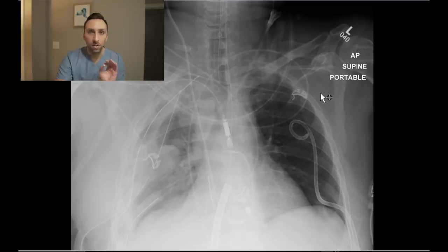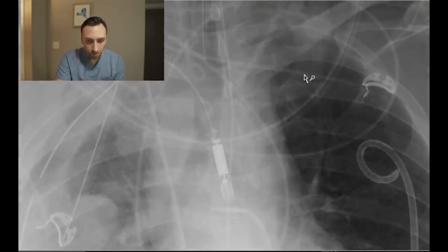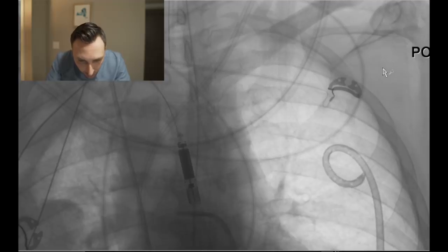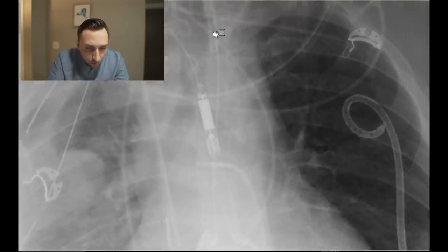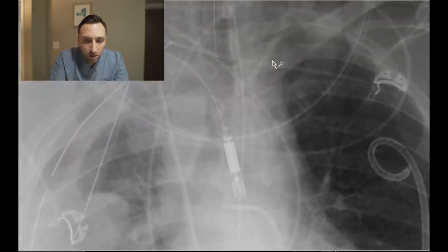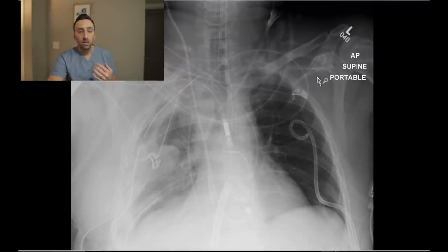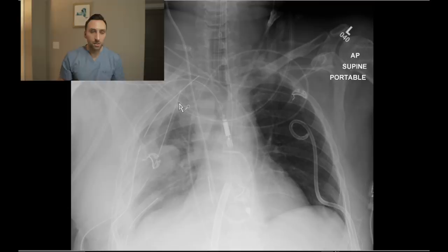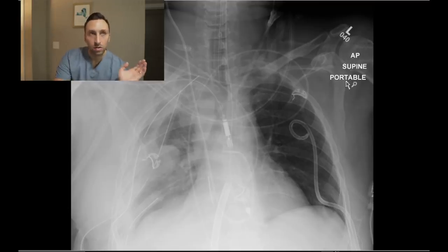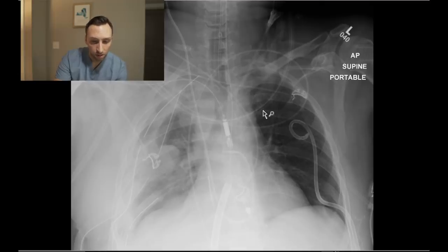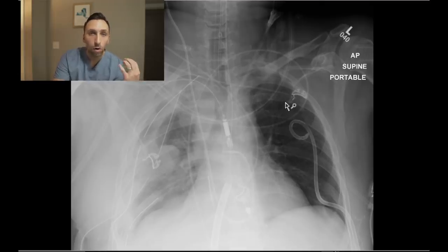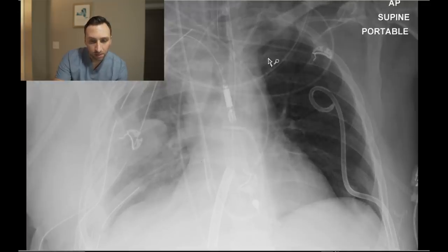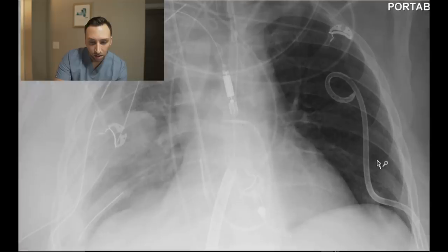Once I've got all the lines and tubes out of the way and confirmed they're in correct position, I move to the actual lung fields. I zoom up just like on the prior x-ray example and make sure there's no pneumothorax — I can switch to inverted windows if needed. This patient does have chest tubes in, so a pneumothorax would possibly mean the chest tubes are not working properly, but I don't see one in this case. It's often very difficult to see a pneumothorax in these patients because they're hunched over and not sitting upright. This patient also has really low lung volumes — hypoinflated lungs — which you can tell by the elevated diaphragms almost obscuring part of the heart.